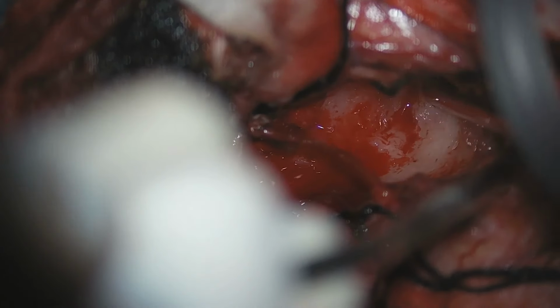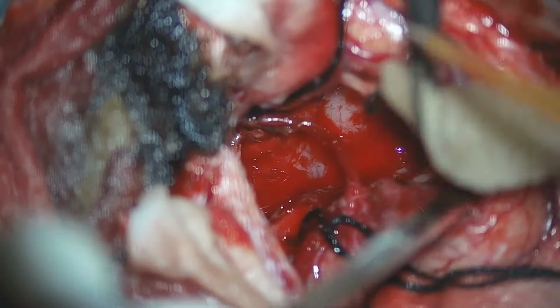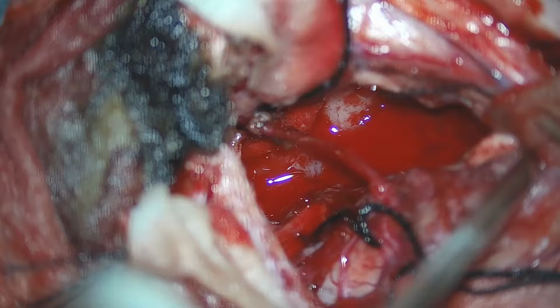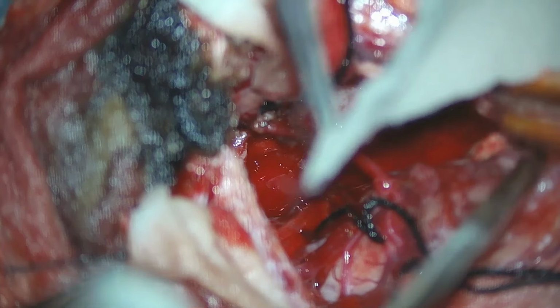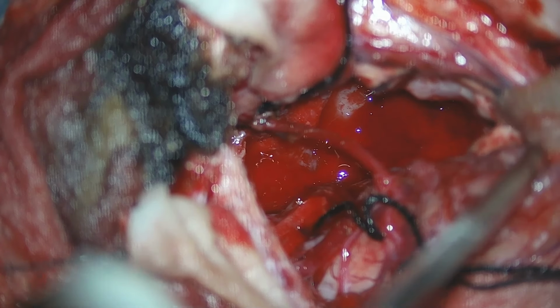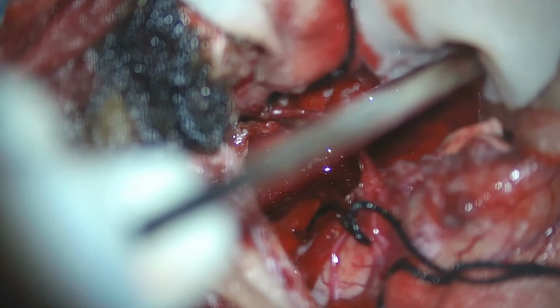The tumor tissue is grayish white in color, which is vascular. We can see continuous ooze from the tumor tissue, and we slowly use the debrider to remove the part of the tumor area. In every step we use cotton patties.